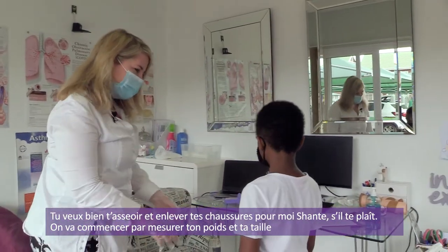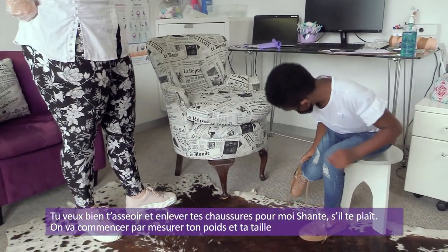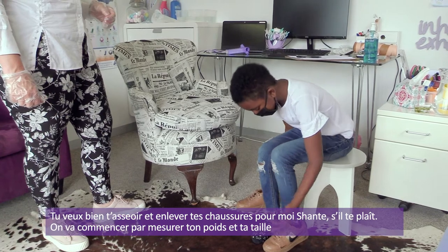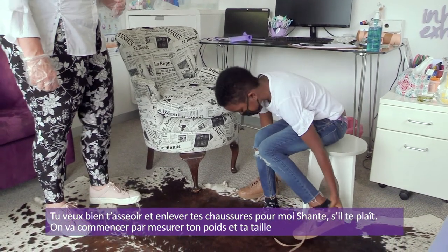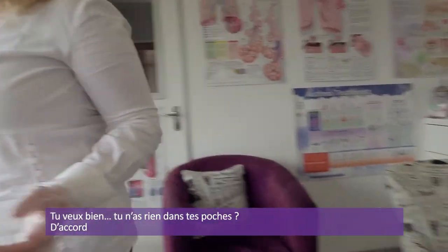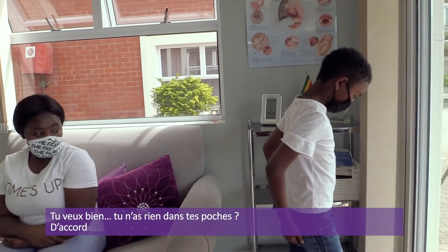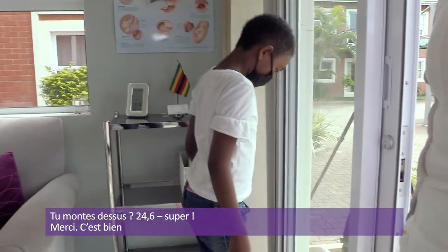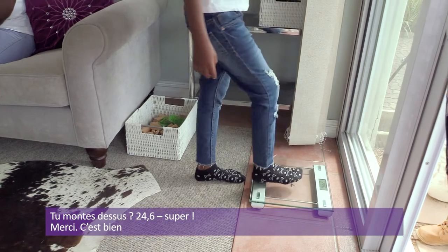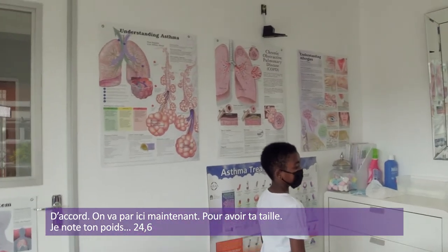So would you like to just take a seat and take your shoes off for me, please, Shanti? We're going to start with taking your height and weight. Good, thank you very much. Okay, let's come over this side. You've got nothing in your pockets? No. Good, okay. Would you like to get on? 24.6, super. Thank you very much. Good, okay, let's go across this side and do your height. So let me record that, 24.6.